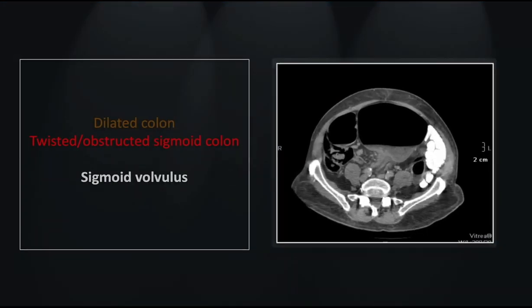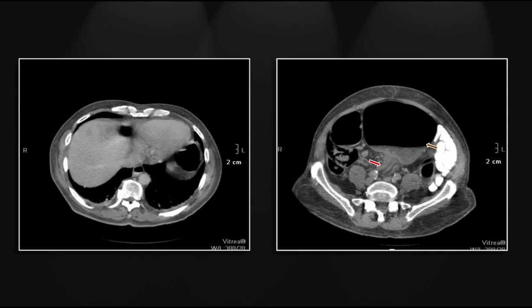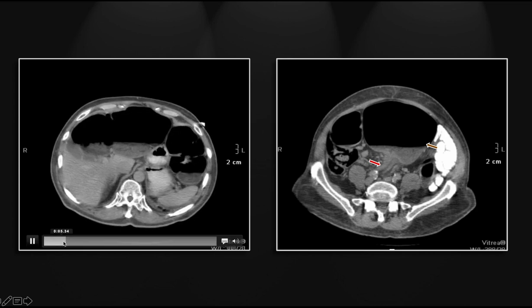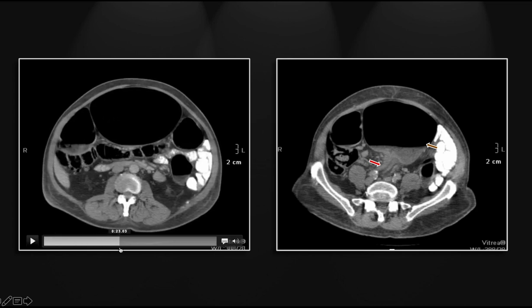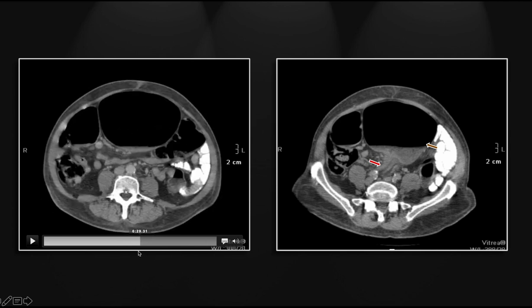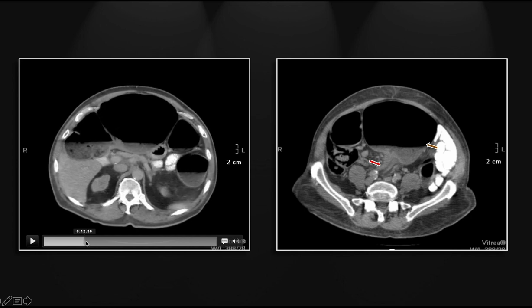Our next case is a sigmoid volvulus. There is marked distension of the more proximal sigmoid. You can see the sigmoid lumen is narrowed, and in fact the sigmoid can be seen to be longitudinally folded upon itself due to the twisting. There is clearly colonic obstruction with dilation of the entirety of the colon, and there in the central abdomen you can see the massive distension of the sigmoid colon reaching all the way up into the portal region.